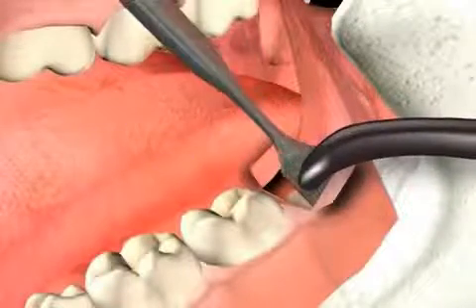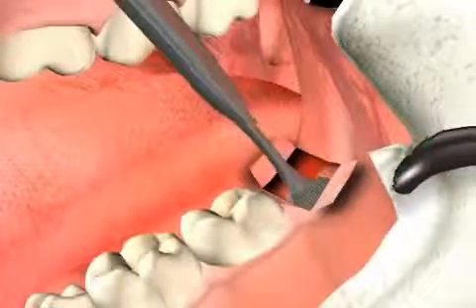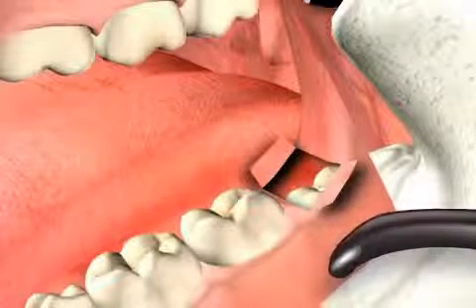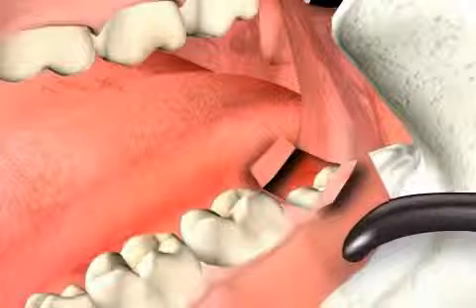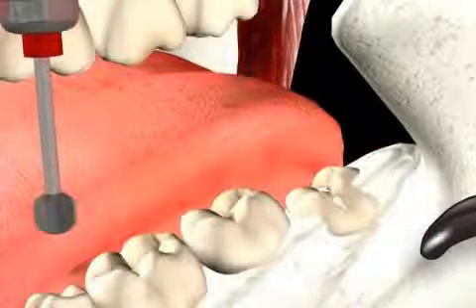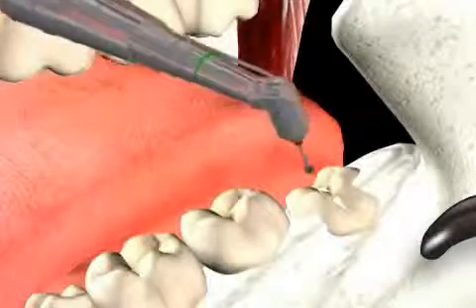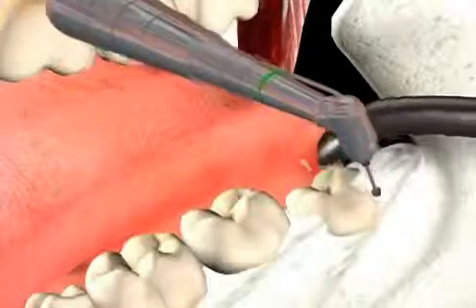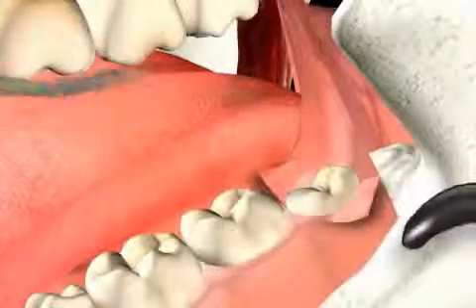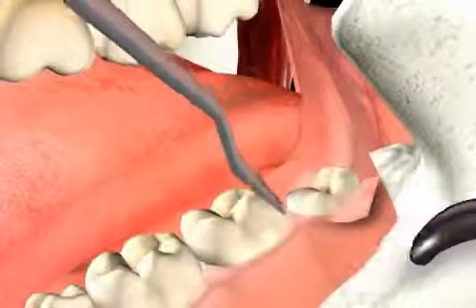The gums are moved to the side with a raspatory, and thus the mucous membrane, including the periosteum, is lifted off the bone. A wide raspatory is placed underneath the periosteum in order to protect the other soft parts, such as, for example, the lingual nerve, because the bone is now removed with a drill. Although the sound of this procedure roars in your head, you don't experience any pain.